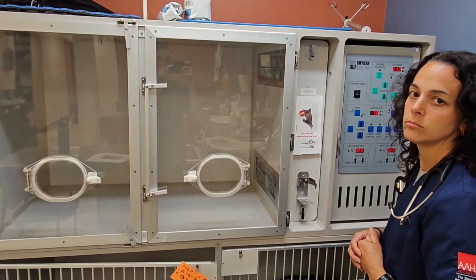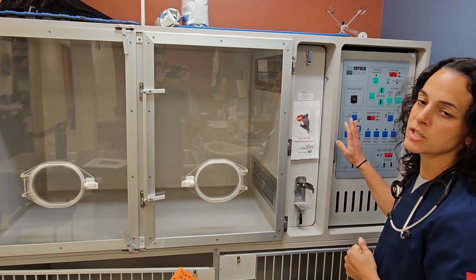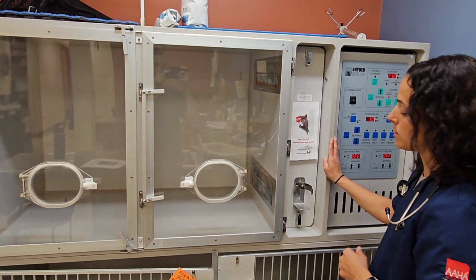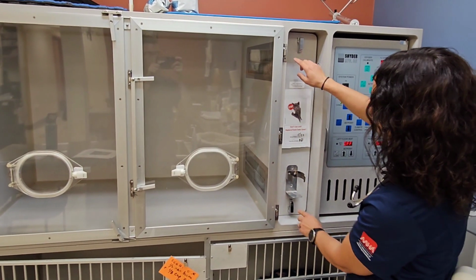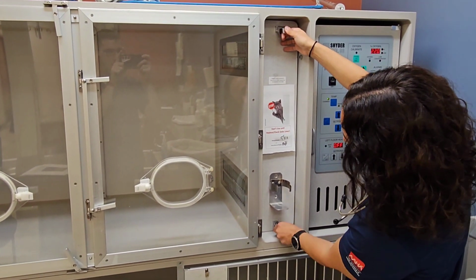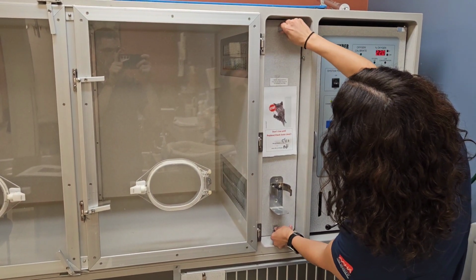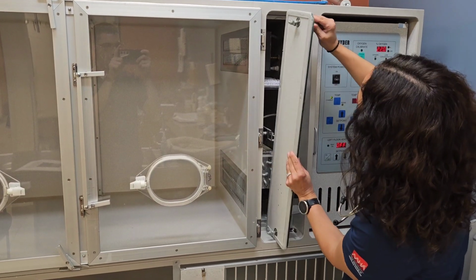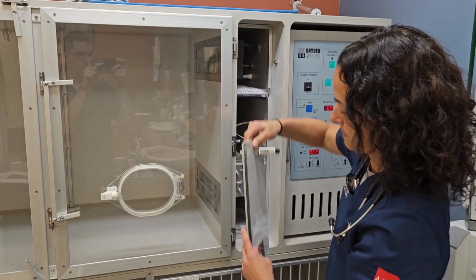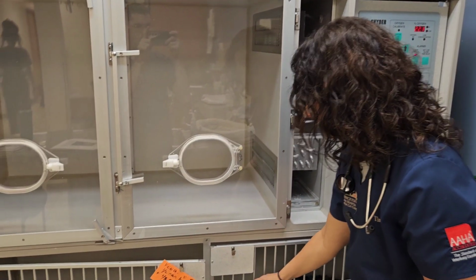All right, another thing we want to do when we're setting up the machine is to check the soda lime and the drip tray. So those are both in this chamber here. And to open this, you have to pop this guy up and that one, and they kind of turn. So you can pull it out. If you see it turns and releases what's holding it on. I'm just going to put this here.